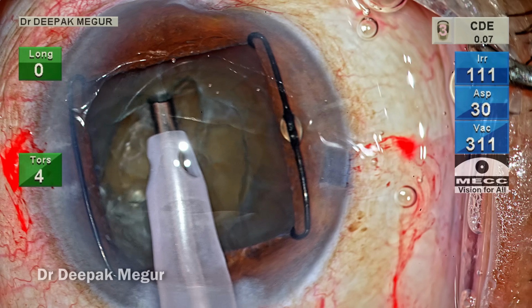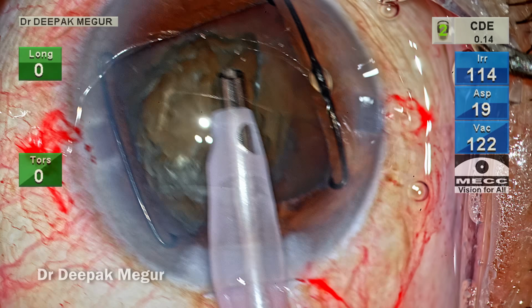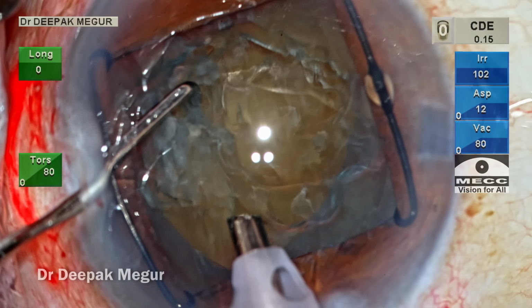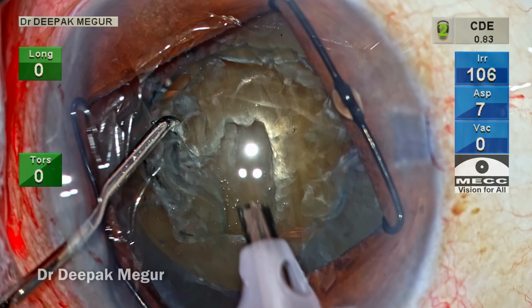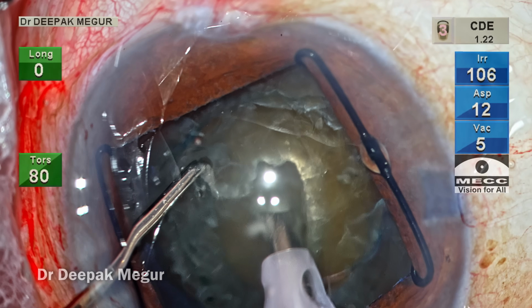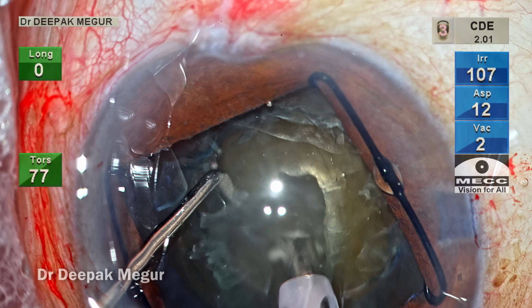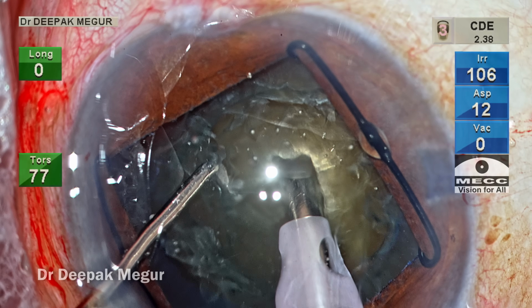Time to emulsify the nucleus. The superficial epinucleus and the cortex is aspirated. So as I'm getting ready to emulsify the nucleus, I will be reminding myself that I'd be as gentle as possible during the chopping and the lateral separation maneuvers. I begin by creating a small trench with a couple of sculpting maneuvers. So about 30 to 40% depth I've reached.